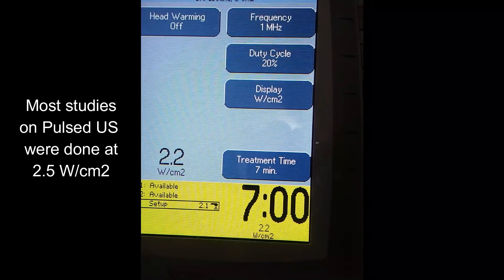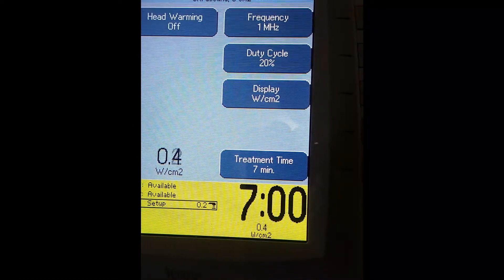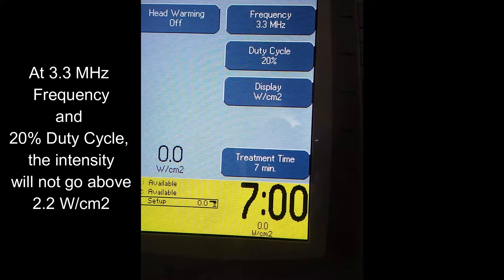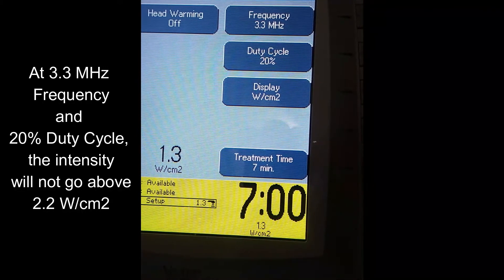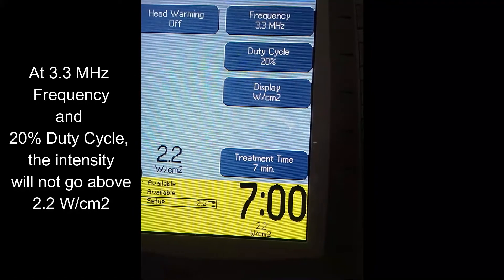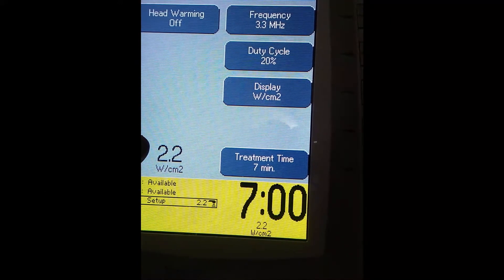One last thing — let's look at how frequency affects the ultrasound intensity for pulsed ultrasound. Setting the frequency to 3.3 MHz — how high will it let me go now? And look at that: it will not go above 2.2 watts per centimeter squared. Remember, we said you could go to 2.5 when you're on the skin with pulsed at 1 MHz, but now at 3.3 MHz, it won't even let you reach that.